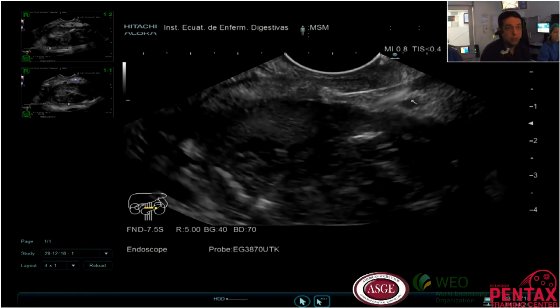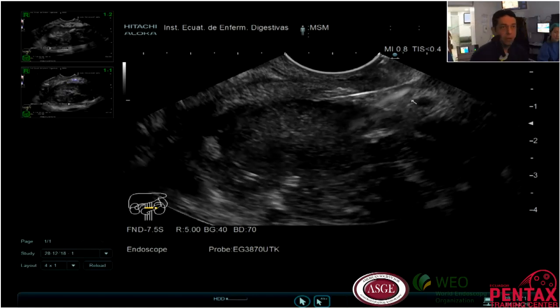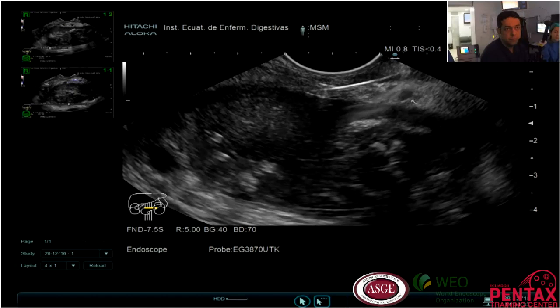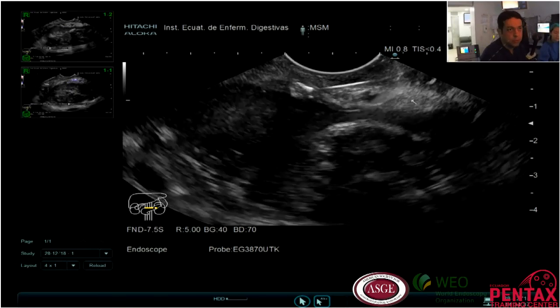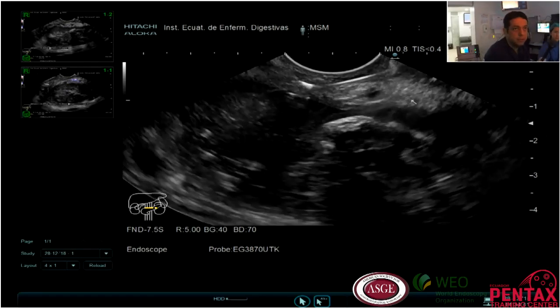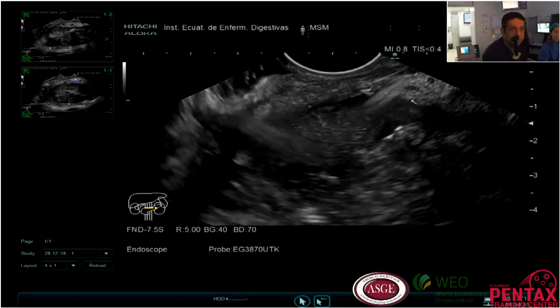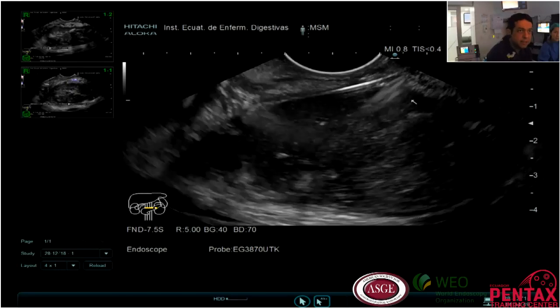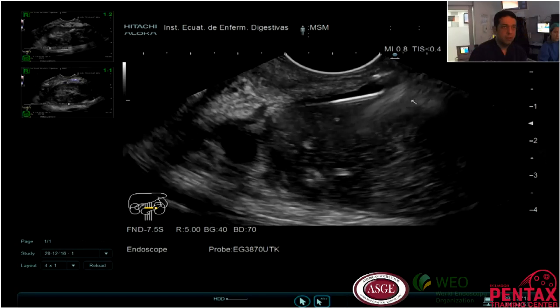So now, I lost my position a little bit. No, me perdiste la posición. Suelta, suelta, suelta. Si entro ahí, voy a hacer un desastre. It is very important to have the access. Ten ahí.